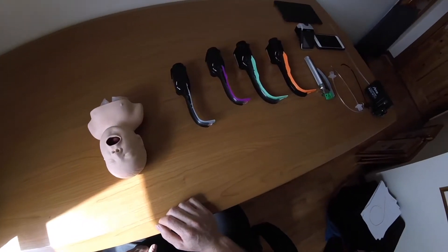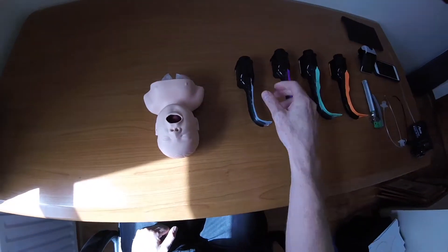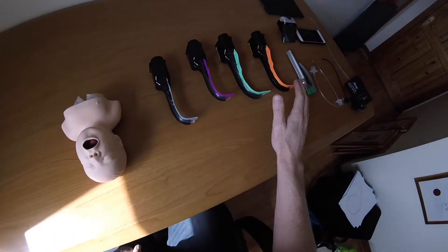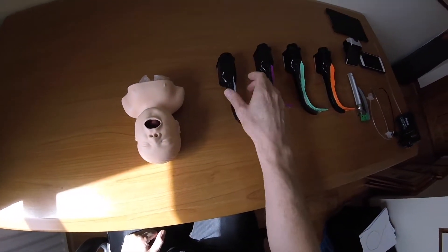This is a quick demo on how to use the paediatric Airtrack. The first thing you need to do is select your size. The Airtrack comes in a range of sizes, depending on which endotracheal tube you want to use.